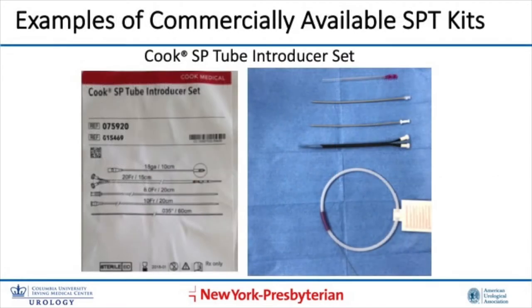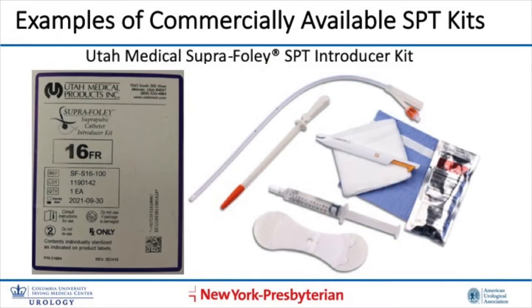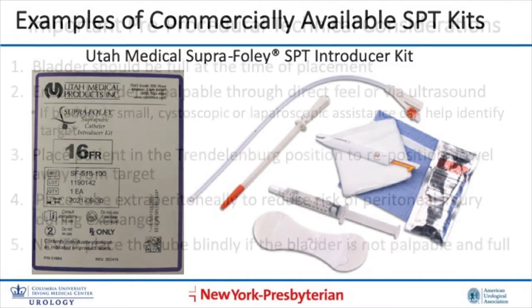Examples of SP tube kits that are commercially available include the Cook SP tube introducer set. Another example includes the Utah Medical Suprafoley Kit. Both of these kits will be demonstrated later on in this video.